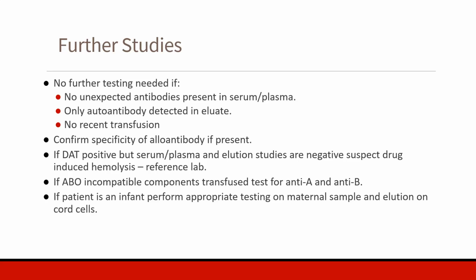Otherwise, if there is an immune antibody, confirm the specificity of an alloantibody if it's present. If the DAT is positive, but the serum or plasma and elution studies are negative, suspect drug-induced hemolysis. In that case, you're going to send the sample to a reference lab.